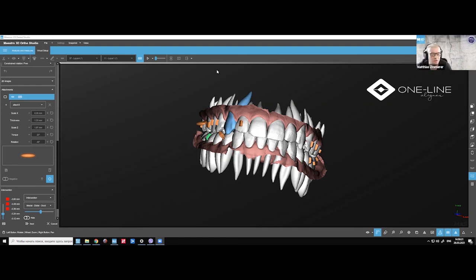Won't that hook break out of the model? I'll just show you. This model which I showed you is actually after the suck down, so it didn't break. So you can understand that. No problem. Yes. No more questions.